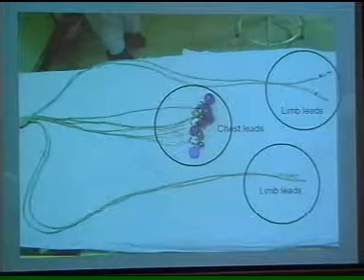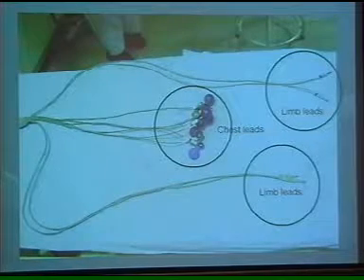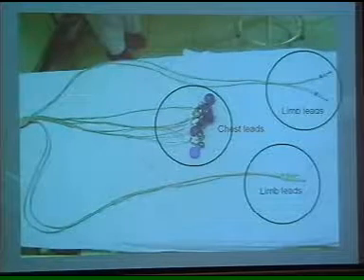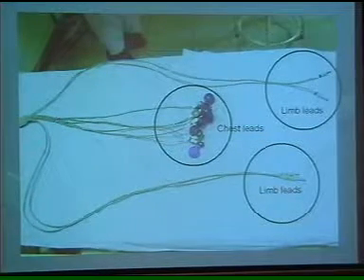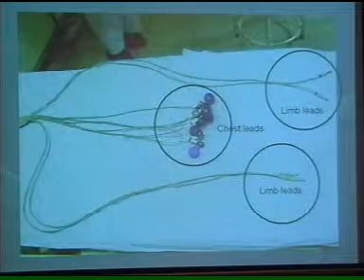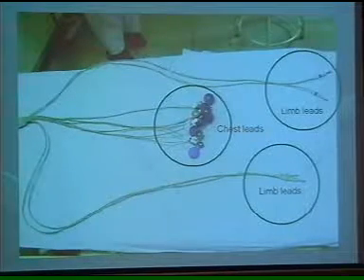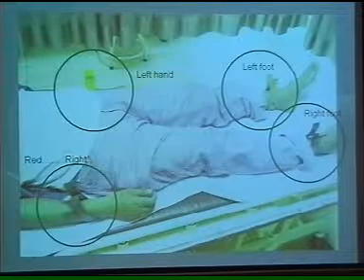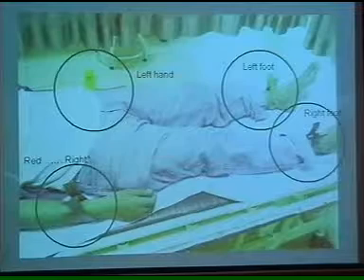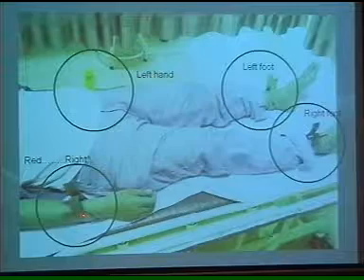So we know that there are 12 leads in an ECG, so there will be 12 wires. No, not 12 wires. Wires are fewer: 10 wires. If you sort out the chest leads and the limb leads, you see that there are different international color codes: red, yellow, green, black, and also a range of colors for the chest leads. These are guidelines almost common to all ECG machines. Like the red one is for the right hand, easy to remember.